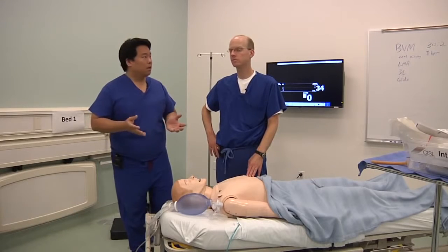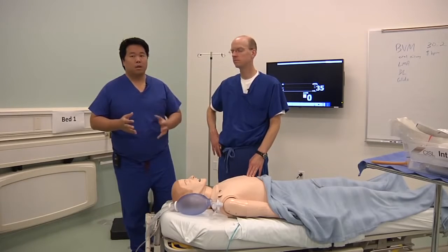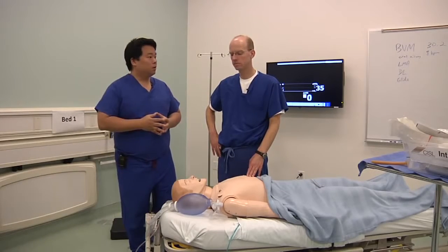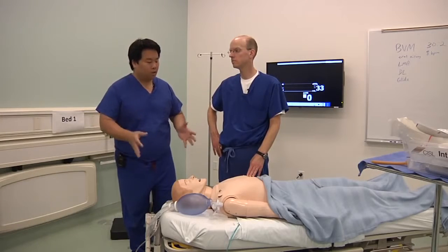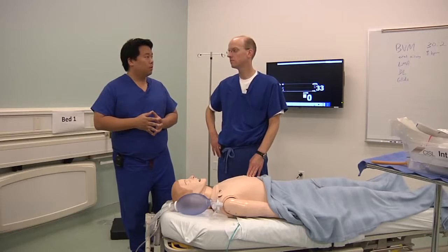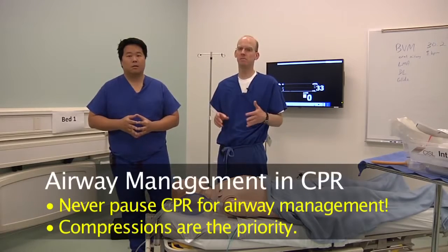Let's talk a little bit, Kyle, about optimizing conditions for airway management. Is it reasonable to pause CPR so that we can get the patient in the optimal position for airway management so we can intubate the patient? It is not. This is a big difference from before.